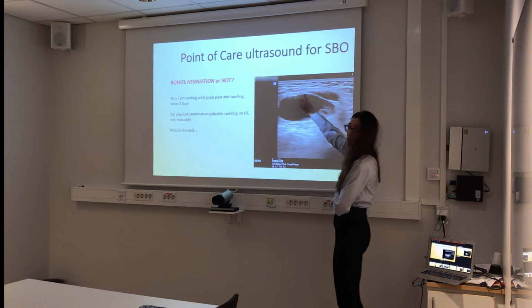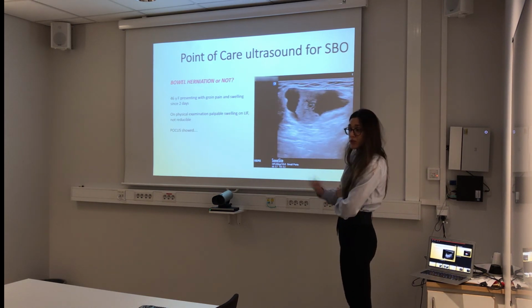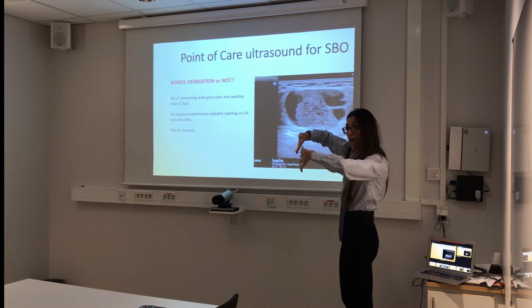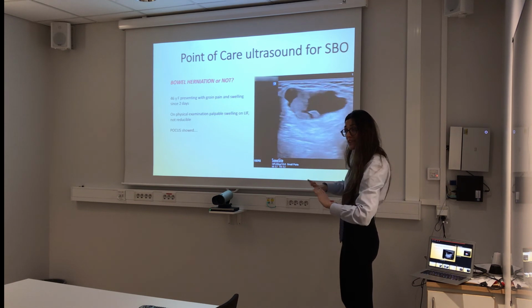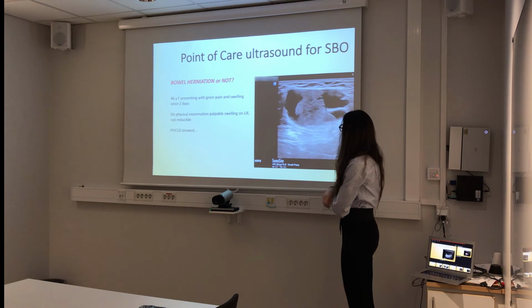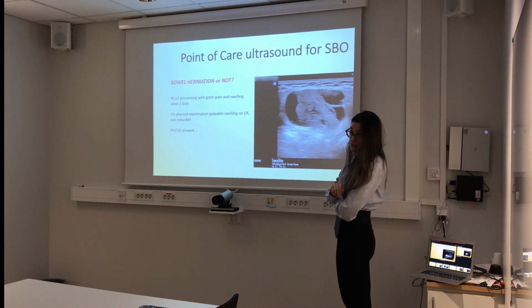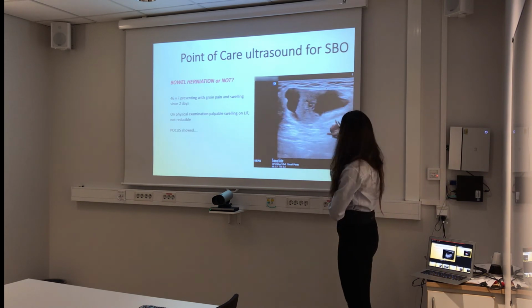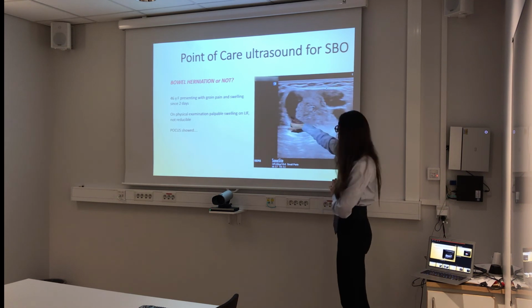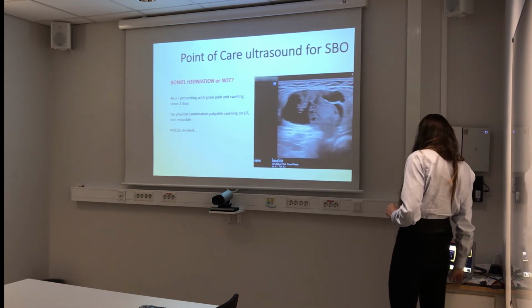This is fat, this is not bowel. There is no bowel. This is free fluid, and there is no bowel in. Because do you remember, the bowel does have a wall? The bowel does have eventually those plicae circulares. If there is bowel incarcerated, herniated, we would see it. This is just fat. And how are you sure about it? Well, you put the Doppler on as well. You see whether there is some sign. And I cannot spot any, besides the hernia capsule, but I cannot spot any walls here. This is just soft tissue inside.